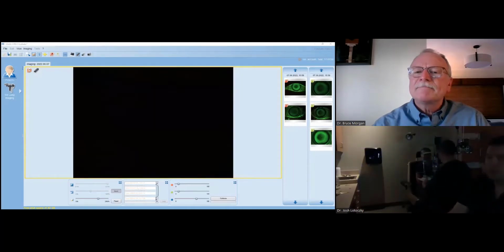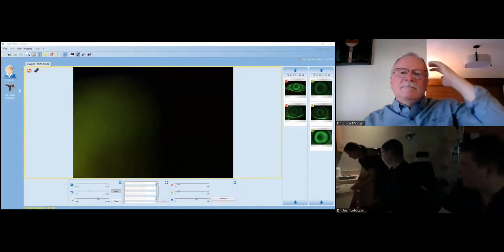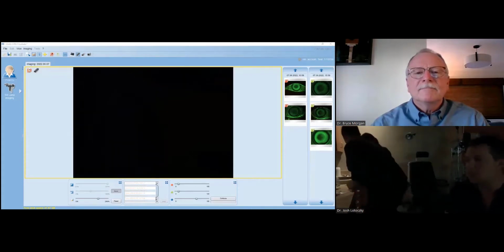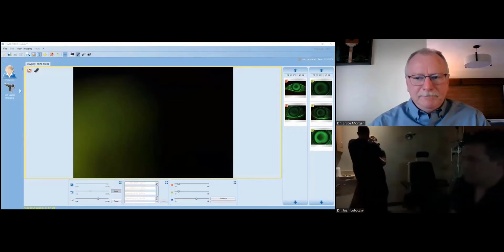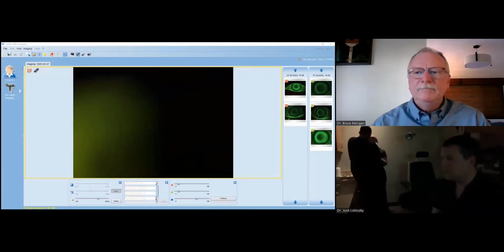Let's move over. We're going to go into another lens. We're actually going to make an adjustment and see what happens. Is the next lens, if I have it right, bringing it down a little bit? It's a shallower lens, yes. Okay, so we are decreasing the depth of the lens. We're going to see if we get more of the impact that we're looking for, a smaller fluorescein band. We had one that was really thin, and now one that was a little thicker than what we might want to see. Now we're going to see if we can get maybe the happy in between.